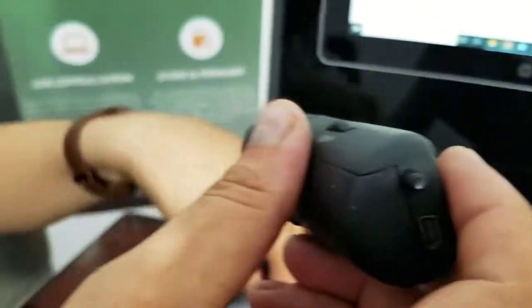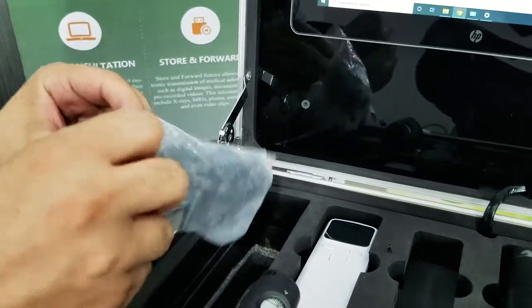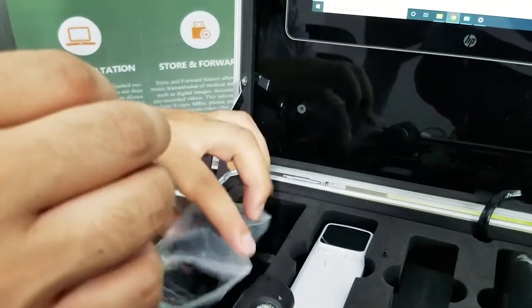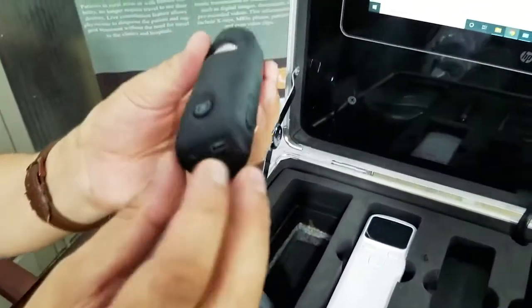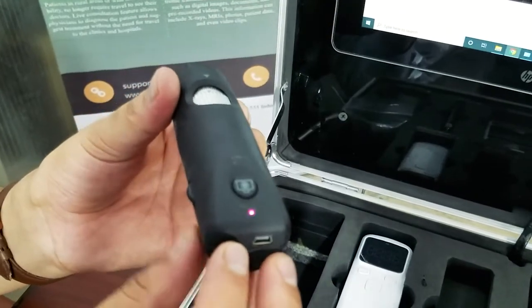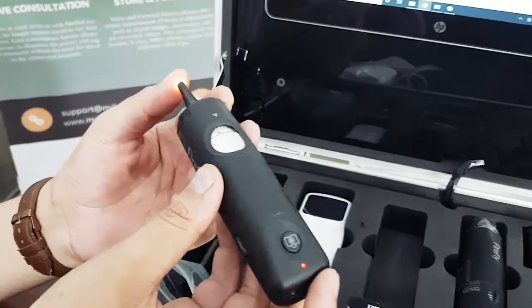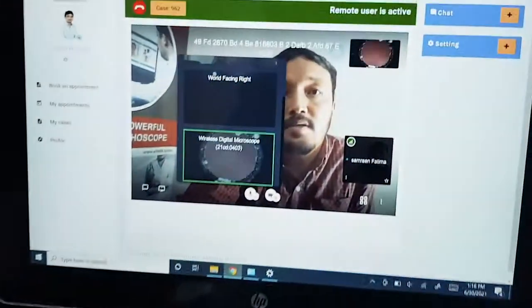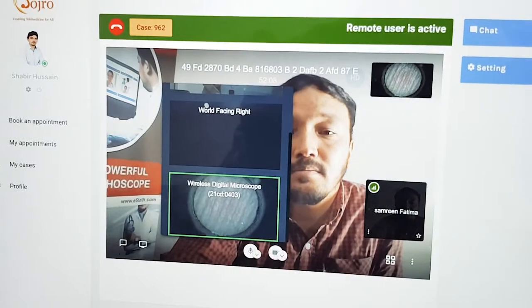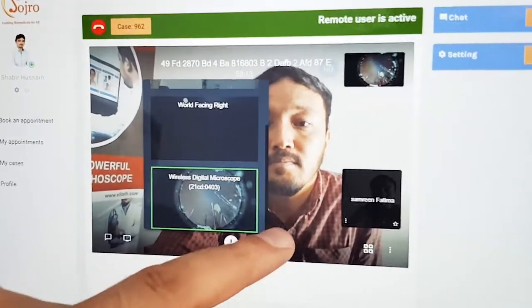In a similar fashion, the otoscope can also be connected by putting a nozzle on top of the otoscope, turning it on, and using the same transmitter that was used for your dermatology camera. The otoscope is turned on and the image is visible both on the patient as well as the physician's end.